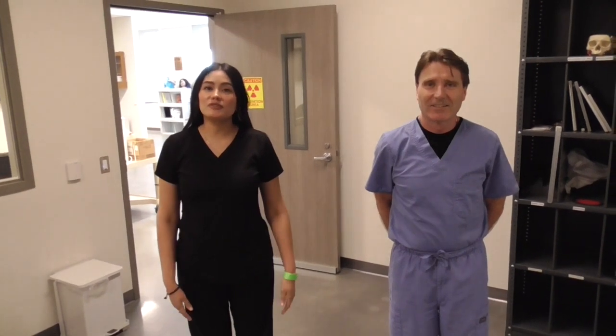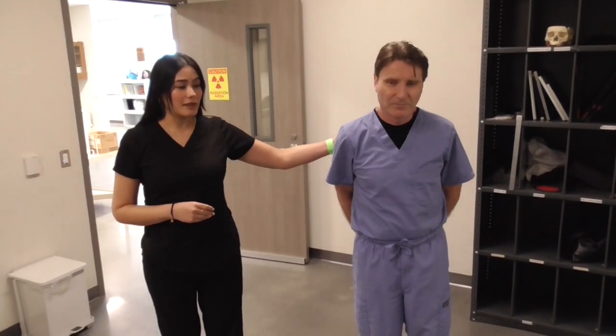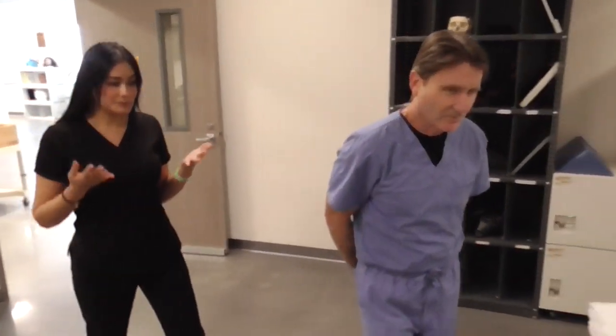We're going to be demonstrating general body positions. We're going to start with the supine and prone positions, and those are done on the table. So I'm going to have you lay on the table, face up.